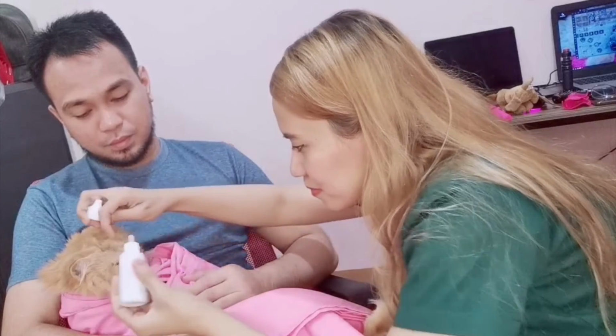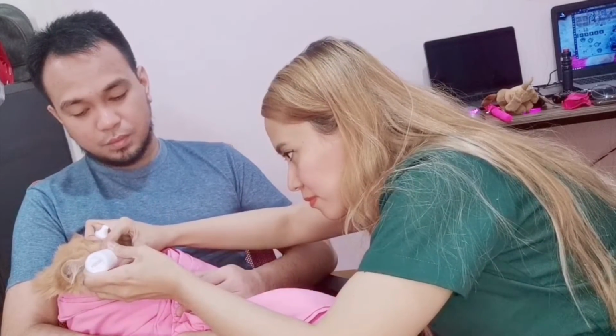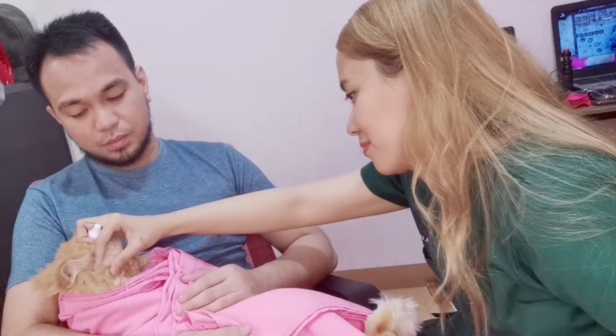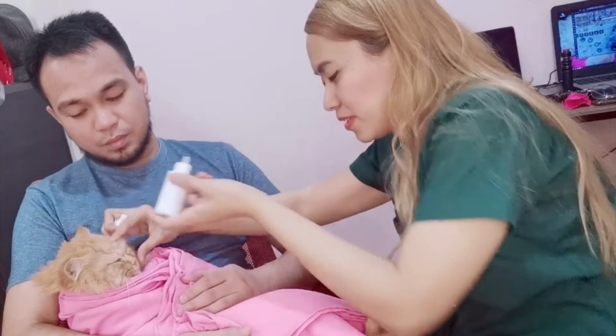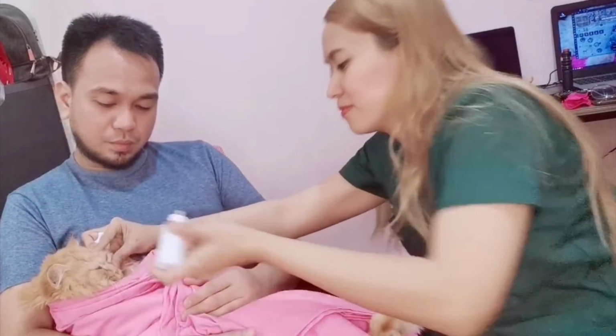If it's difficult, and you can get them lying flat, put a couple of drops onto the skin by the inside corner of the eye. Then, depending on the age, either ask them to blink several times to allow the drops to run in, or gently part the lids to allow the drops to flow in.